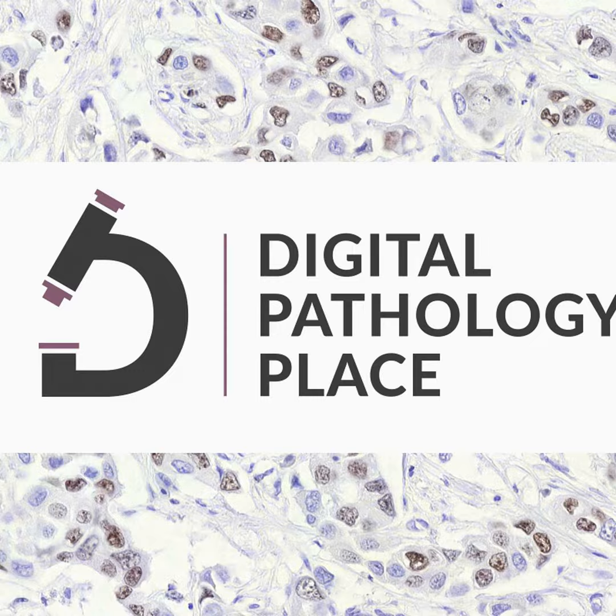So what does the FDA clearance allow us to do? Well, it allows us to make specific claims that are really no different than all of the other whole slide imaging system claims. In fact, if you line up all the intended use statements for all of the systems, they're like identical septuplets. They're pretty much the same. The only difference is the different components and the system names.